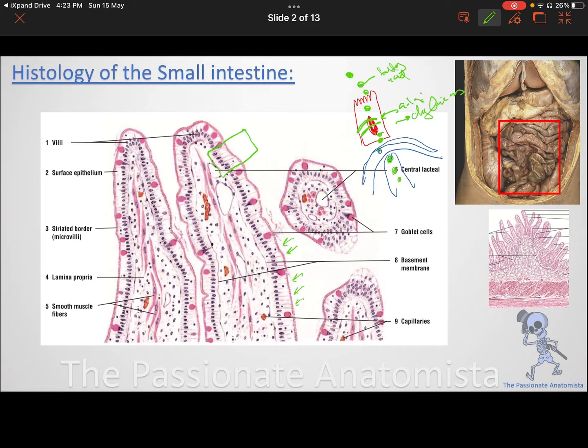So inside the lymph of the lacteal, you absorb your chylomicrons, and that is the way you transport it to your circulation. It's very important to know that your lacteals are this lymph vessel that is in the core of the lamina propria, in the mucosal fold itself, in the villus.